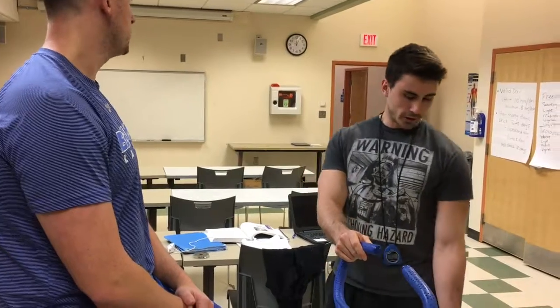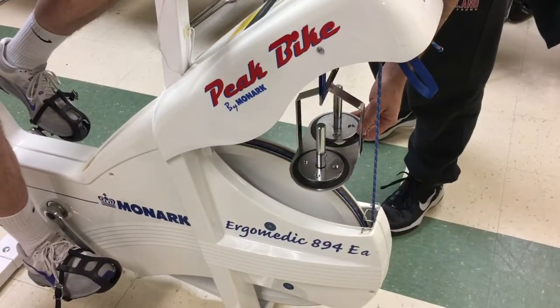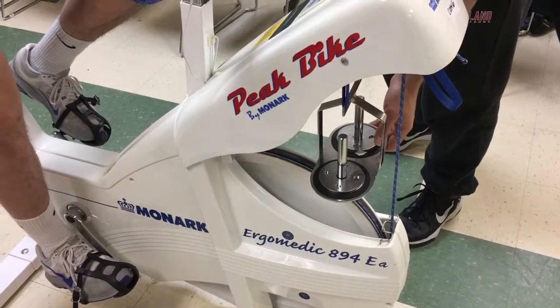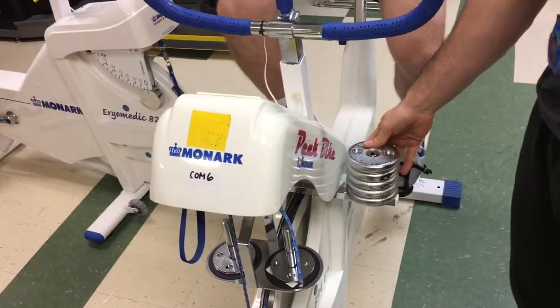For the warmup you're actually going to start out with 20%. I have already put on the appropriate weight. The basket is one kilogram, so he has about 1.4 kilograms on here. The working weight that he's going to use is 7.5% of his body weight — that's already calculated. We already have all the appropriate weight right here, and this will be what he's going to be using on his lap basically about the last minute of his warmup.